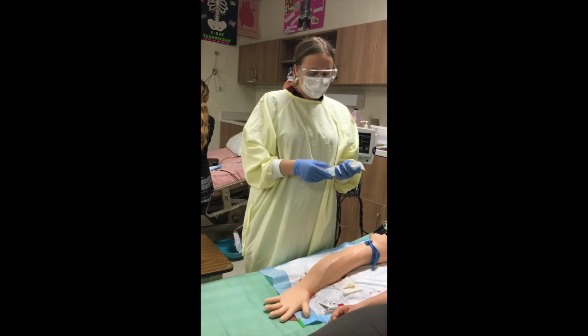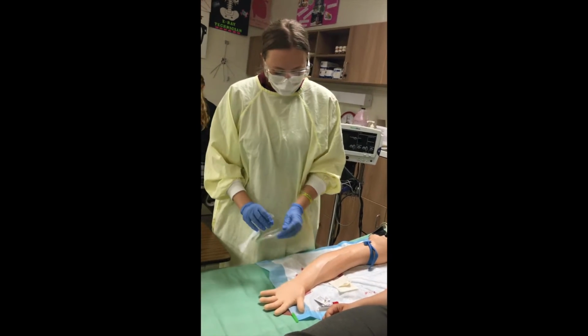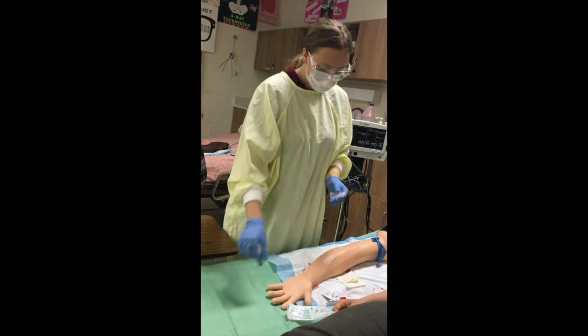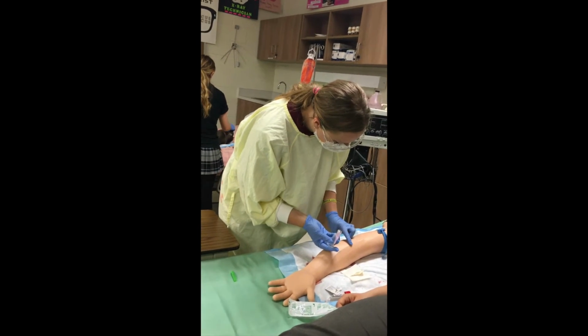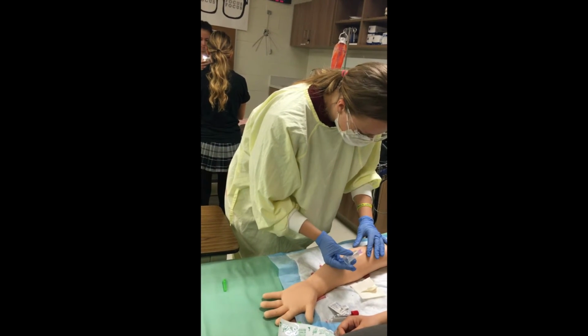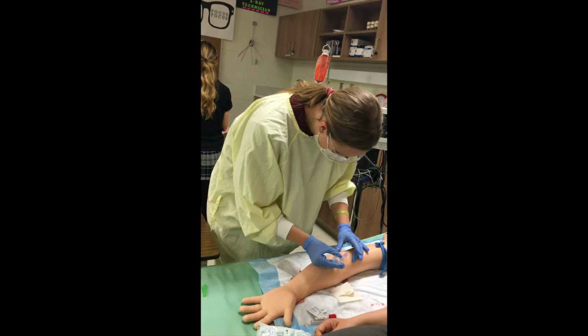I then have my vacutainer, which I'm gonna open up. I can take the safety off, the cap off, and then the hole in the needle goes towards the sky. I can then find an appropriate place for the vein and stick your needle in.